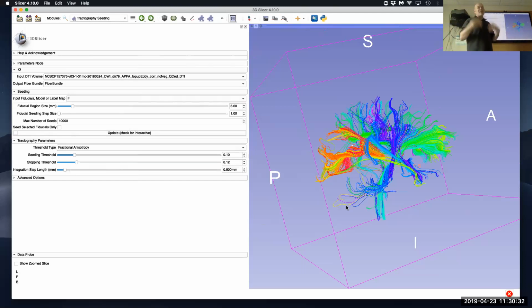So now we're doing the DICOM conversion for the project, not the outside site. They were using MINC tools, that is MNI, and I'm pretty sure they'll update those tools with our feedback. But for the time being, we want to make sure that incoming data is getting QC, so that when there are issues, we can, within a reasonable period, let them know there are issues with the scanner.